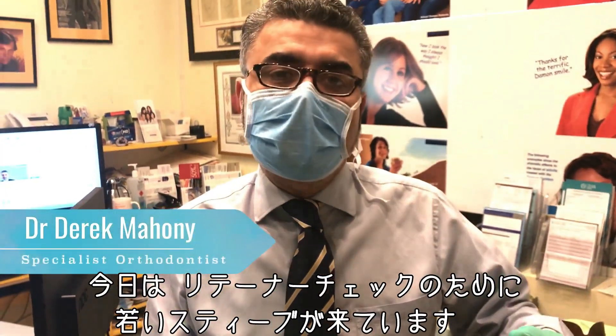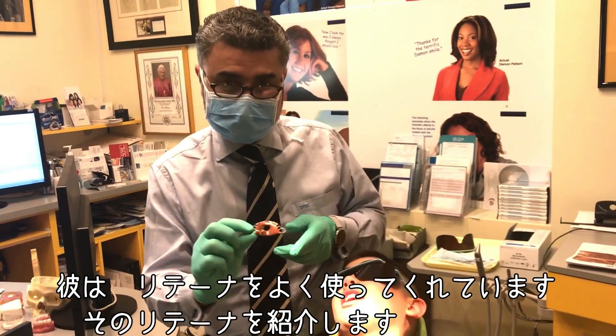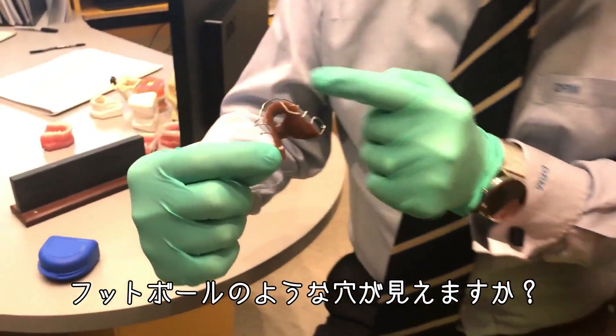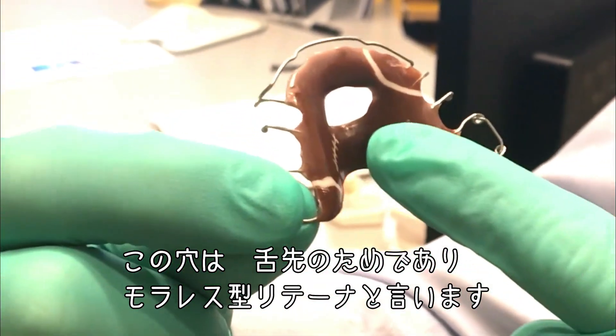We're doing retainer reviews today and young Steve has shown up. Steve's done a great job with his retainer. Let me introduce you to Steve's retainer — it's a football, right? So other than the football that he's chosen, can you see that hole? That hole is for the tongue. This is called a Morales style retainer.